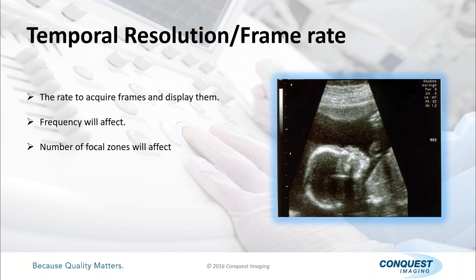I know Chris has a question on there about that. I wish there were, and it seems like there should be some way of knowing that, but I can only tell you the range of the probe, and I assume they're using its lowest and highest range, and the very middle frequency. But there's nowhere you can find that on the system itself.